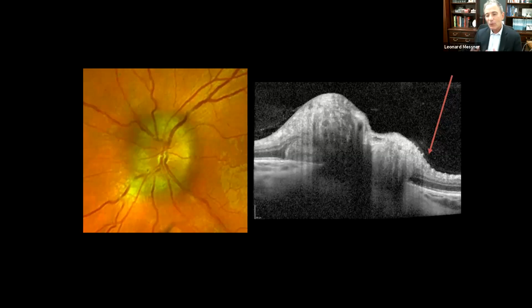This gets back to the old 30-degree test that some of us used to do many years ago. It's an ultrasound test in order to look for fluid within the optic nerve. But basically, if the patient is looking straight ahead or looking inward somewhat, the optic nerve is somewhat kinked within the orbit so that there is this damming or buildup of fluid. And that's what leads to these folds.